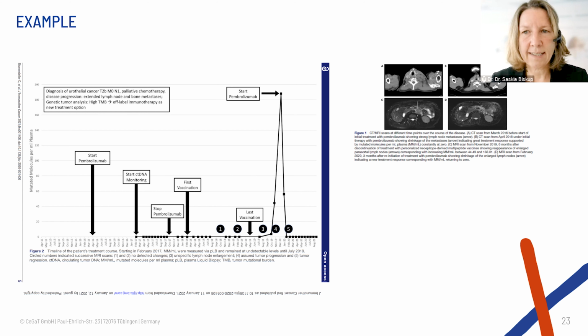And the patient just had a tiny little lymph node that we didn't know whether it was cancer or inflammation, but because of the digital droplet PCR, we knew 100% that this is cancer. So we said, you have to start pembrolizumab again. And this is when you see that the positive droplets immediately disappeared and went back to normal. And we do the droplet PCR every 3 weeks, and the patient is without tumor DNA in the blood and without symptoms and is leading a normal life.